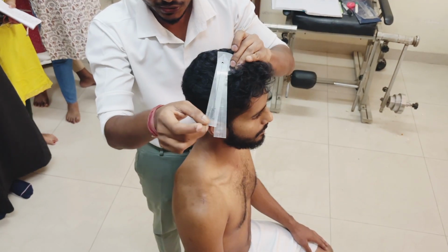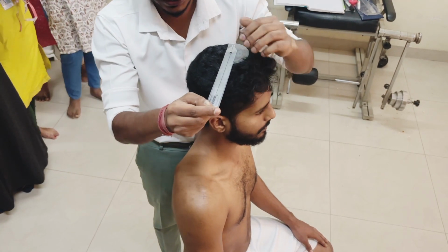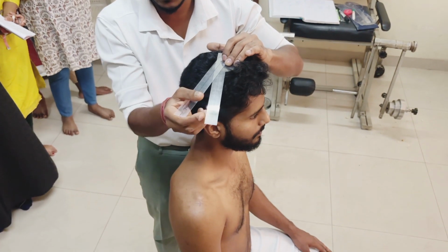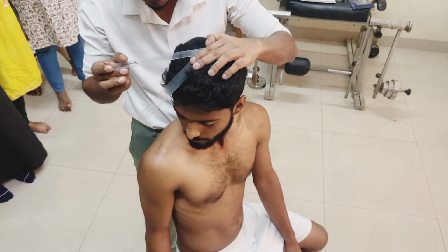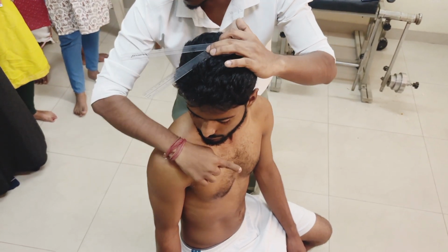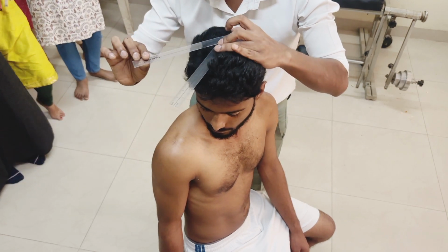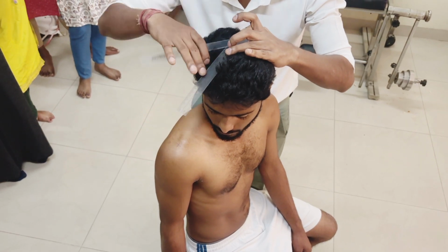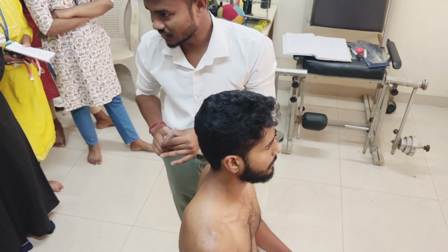Now I am going to move the movable arm, corresponding to the acromion process. The point is, this movable arm should be straight to the acromion process. So this is the stable arm. Leave the stable arm. Now I am asking the patient to do rotation. So the movement will be like this. Firstly the patient will be in the neutral position, where it was corresponding to the resting acromion. Now he did rotation, and this movable arm is exactly corresponding to this acromion process. So we will measure the distance, how much range it comes. So that is our rotation.